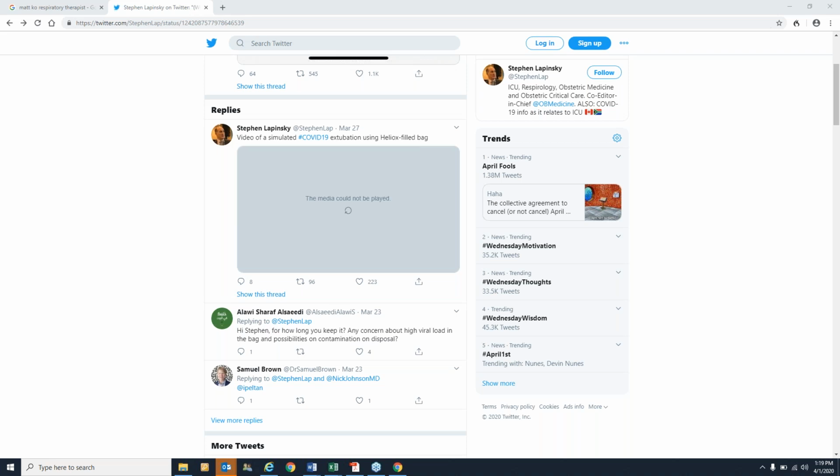Have you had more success with APRV versus ARDSNet ventilation? Oh, such a loaded question. I don't even know if I want to address this. Because we are a downtown teaching hospital, and because we adhere to the ARMA trial and the ARDSNet group, we do adhere to lung protective ventilation, mostly meaning ventilating with tidal volumes at 6 cc's per kilo of ideal body weight. The challenge with ventilating using APRV is that the release volumes, again, those aren't positive pressure volumes, but those release volumes tend to extend to 10, 15, 20 cc's per kilo of ideal body weight.